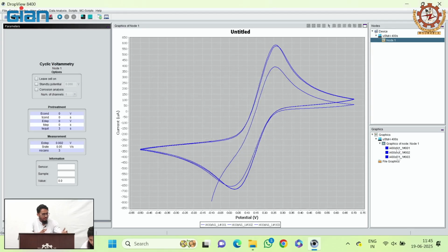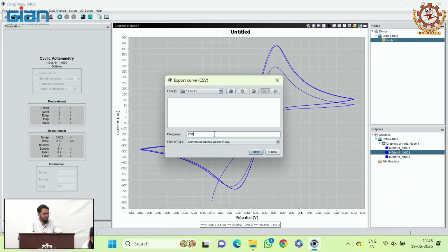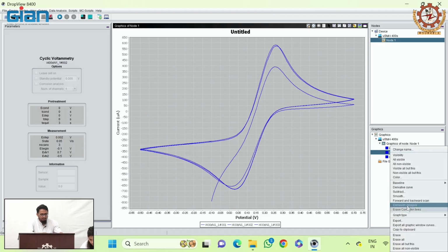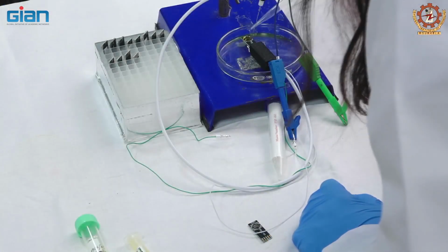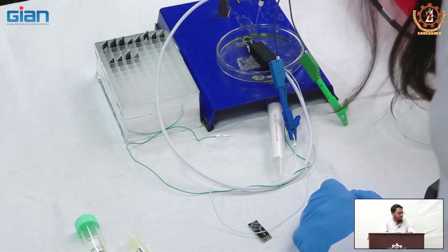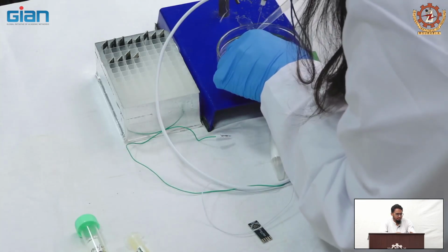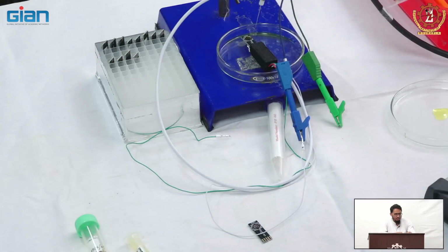So when you all do the experiment live, you can note down the oxidation potential and reduction potential. So we will proceed with the cleaning of the working electrode with DI water. First we will remove the fluid using a pipette, then we will wash it with DI water. The detailed protocol we will give to you at the end of the course. You can have it and repeat it.